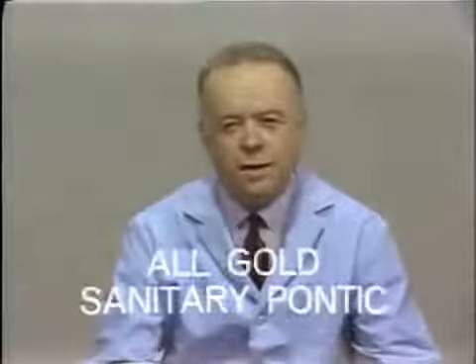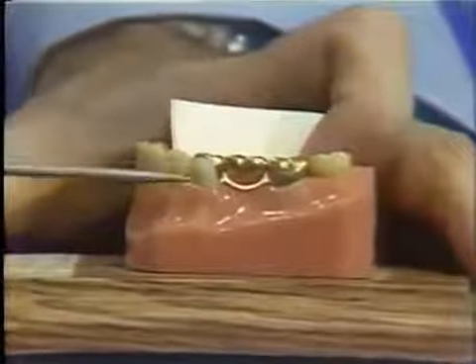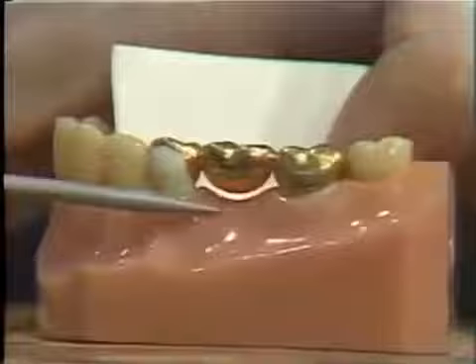The all-gold sanitary Pontic is used in mandibular molar regions where aesthetics are not critical. And I have here a model on which I think you can see a typical all-gold Pontic in a 3-unit bridge replacing the first mandibular molar. I think as the camera closes down, you can recognize the approximately 1 millimeter space between the base of the Pontic and the mucosa here.